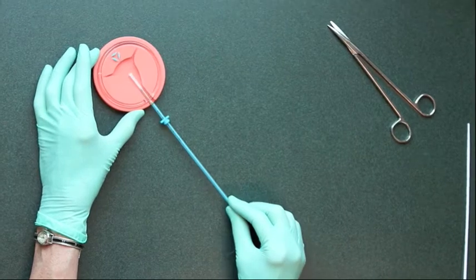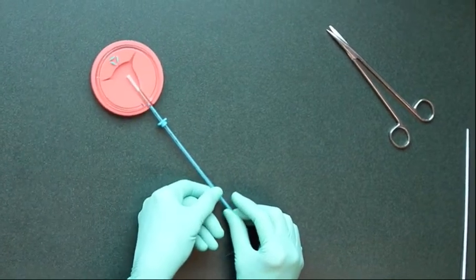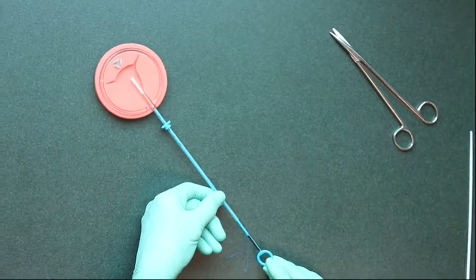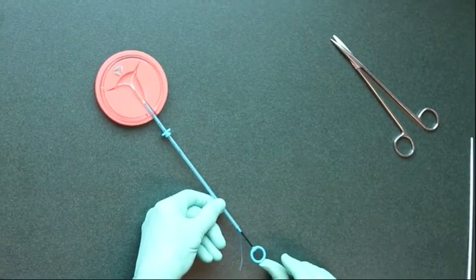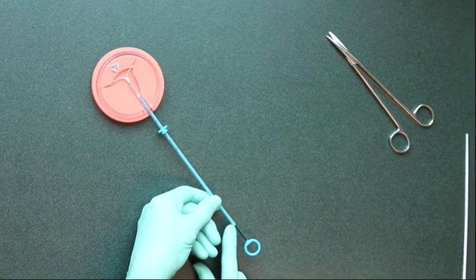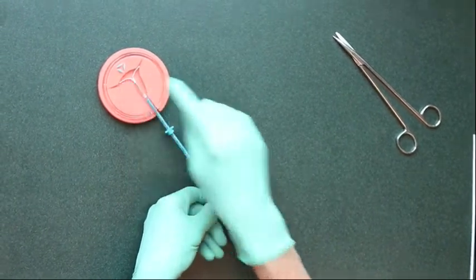Now you can advance the IUD into the uterus, giving yourself a little bit of room so that you can let the arms out. You do that by pushing on the plunger right up to the black mark. That allows the arms to be released.